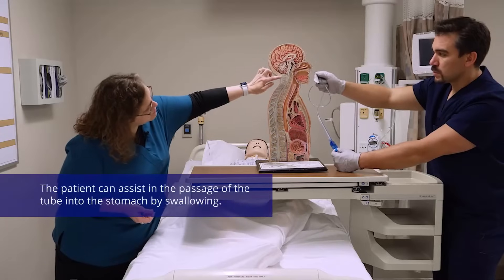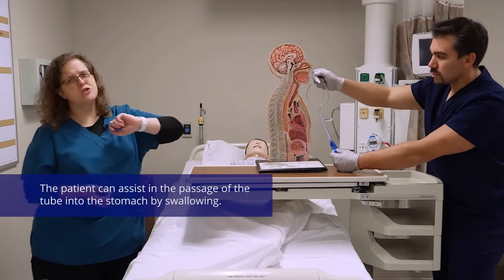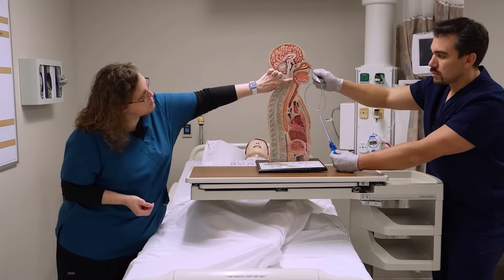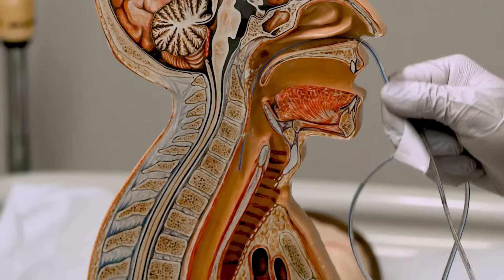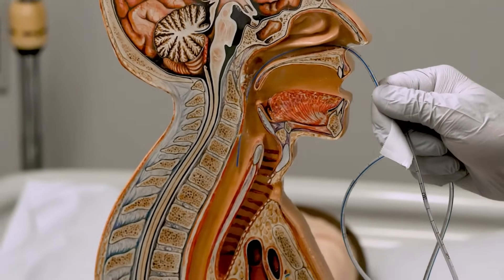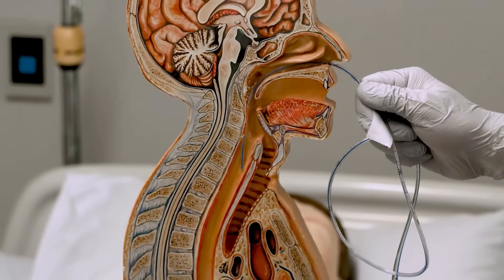What you'll notice is that the esophagus and the trachea are super close. So as you get about halfway down with your tube, if you're going into the trachea and lung, they're going to start to cough. And if you hold the tube kind of still, you're going to notice that they breathe in and out the tube. Not good.